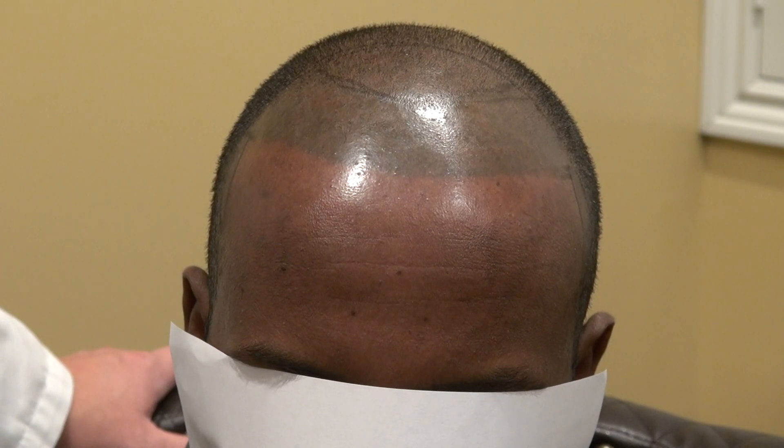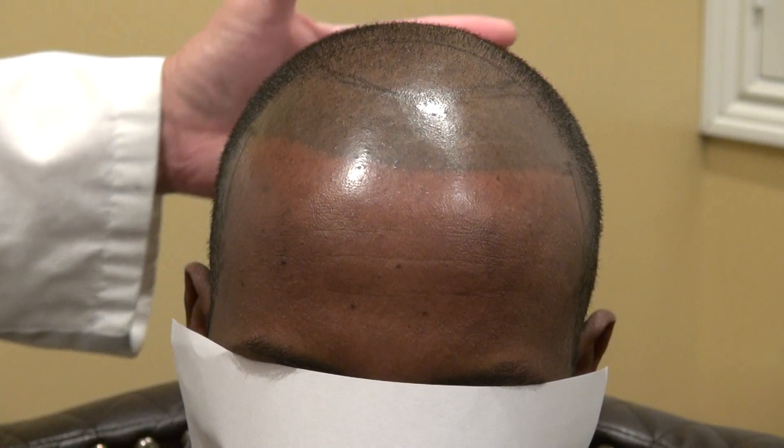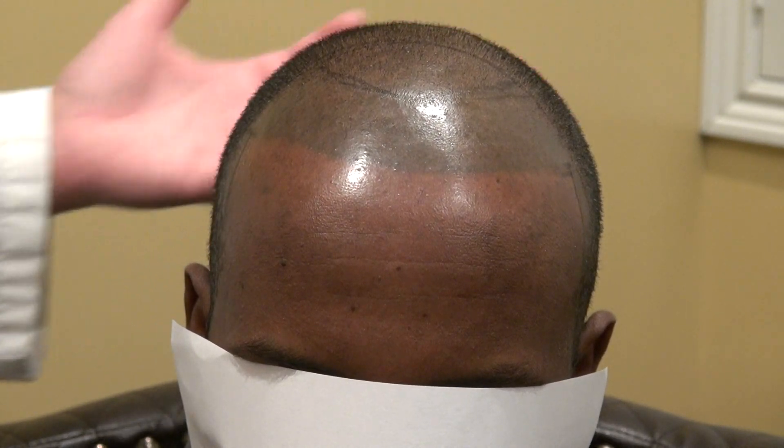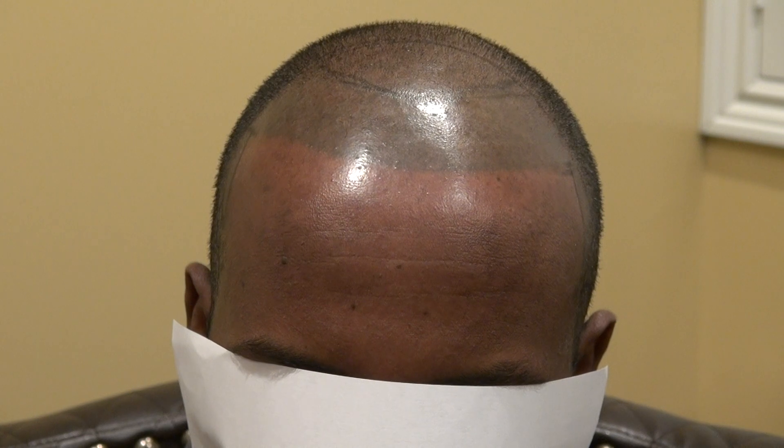This is the hair transplant restoration surgery on a patient who had a micropigmentation tattoo, using the FUE method. The FUE leaves tiny dots of scars — thousands of dots scattered throughout the back — but the dots are so small it allows you to really shave your hair short, to a 1, 2, or 3 guard depending on the individual.